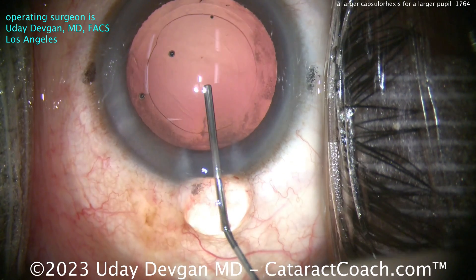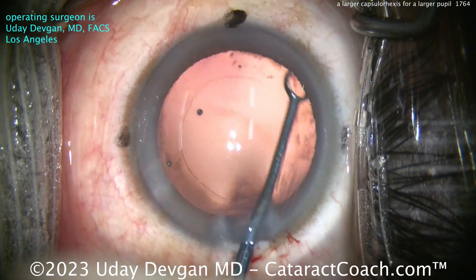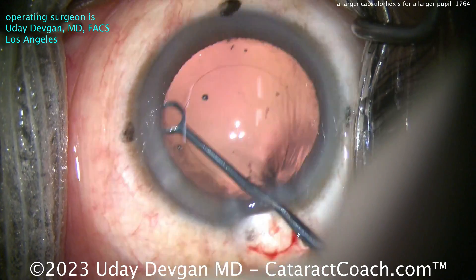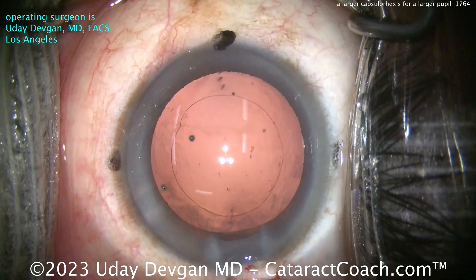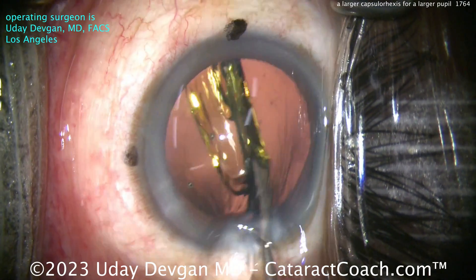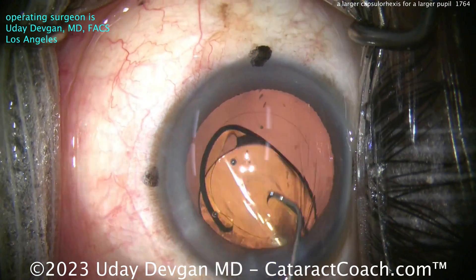There's the viscoelastic. Looks like a pretty good rhexis there — the proof is going to be when you get the lens in the eye. Let's do a little capsule polishing here, clean up the anterior capsule rim and get some of that debris off. I've enhanced the red reflex in the video post-production so you get a really bright red reflex, which makes it a more enjoyable video to watch but also makes it look like more debris than there is. Here comes the lens going in — single piece acrylic toric lens, putting that in the capsular bag. Moment of truth: compared to that six millimeter optic, how did we do?